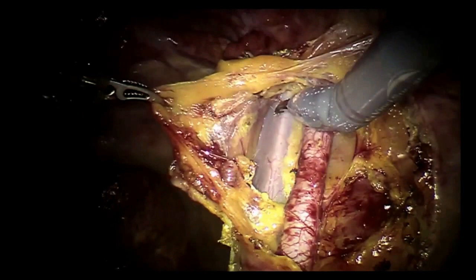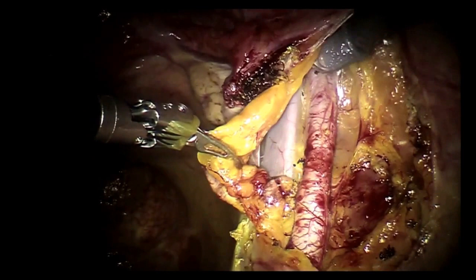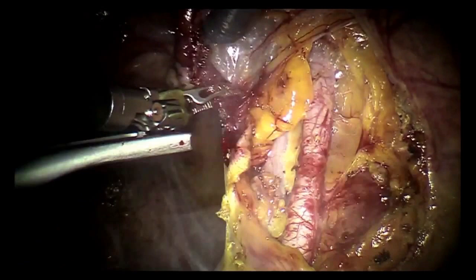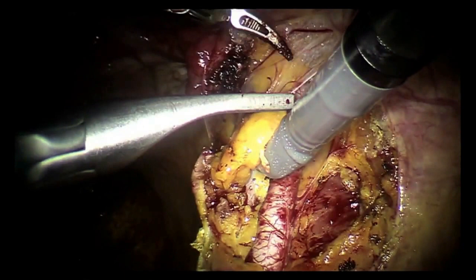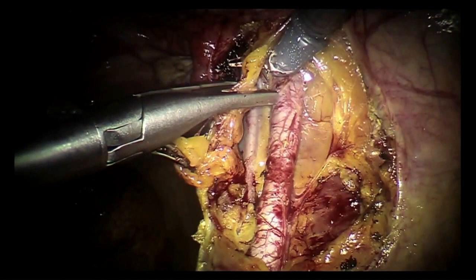Back clip, please. One second. Here you go. Wet clip. Distal, right there. Good. Hang on. No. Go ahead. Distal. Hit it.